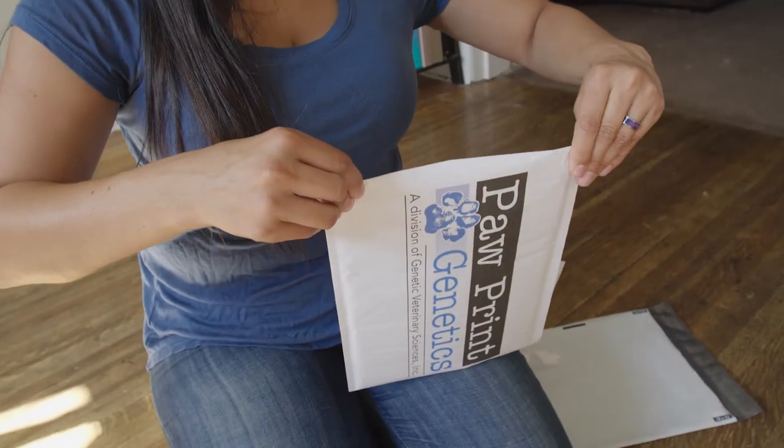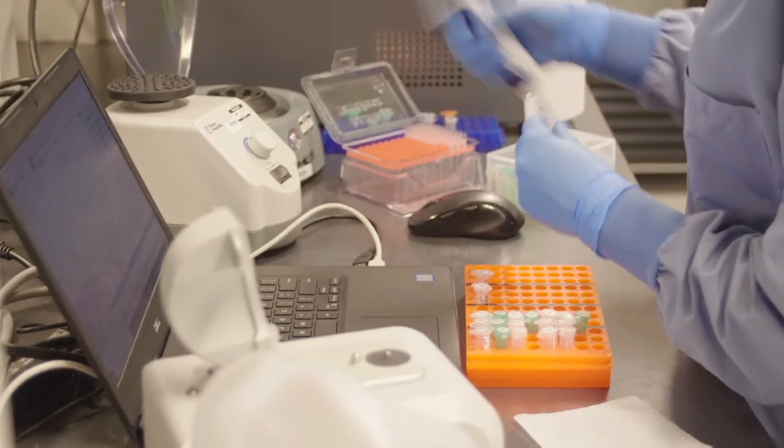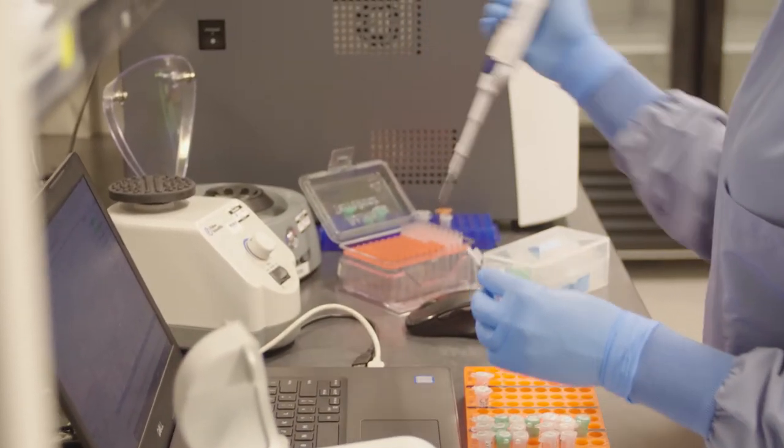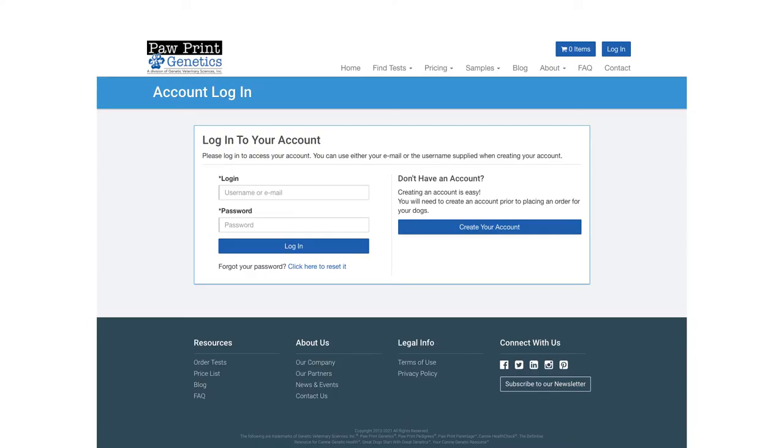Be sure to mail it back to us promptly. We'll send you an email confirmation when your sample arrives at our lab. In about two weeks from our sample receipt, your results will be added to your online account.